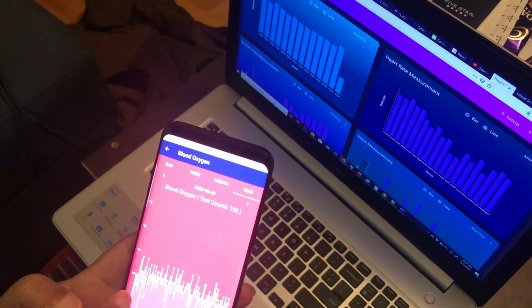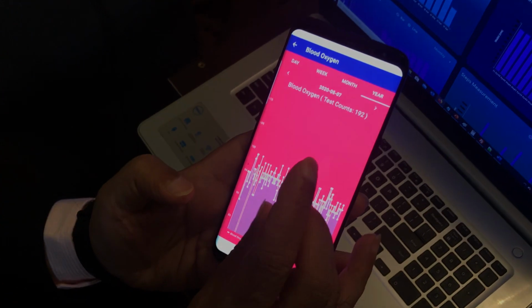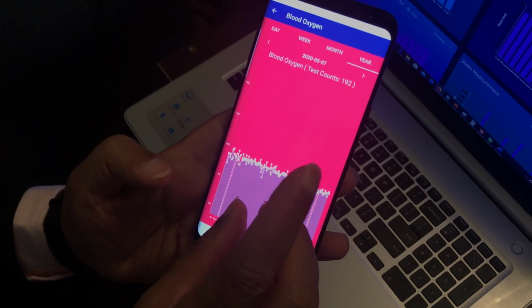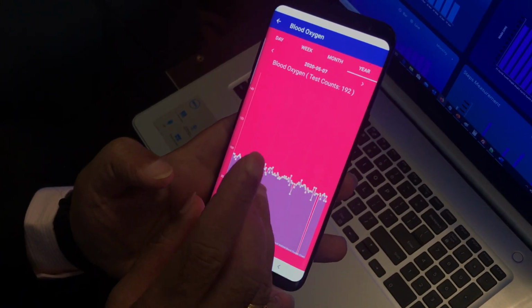Now as you can see, in the cumulative yearly graph, you can see all the peaks here. And now when we zoom, you can see the dots. This sparse metric shows you consistently the values represented therein.